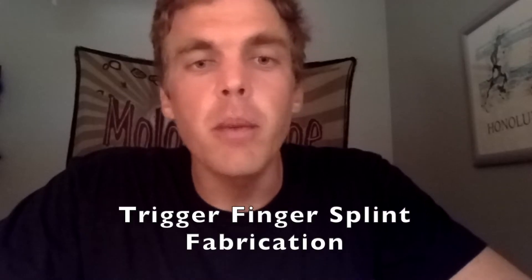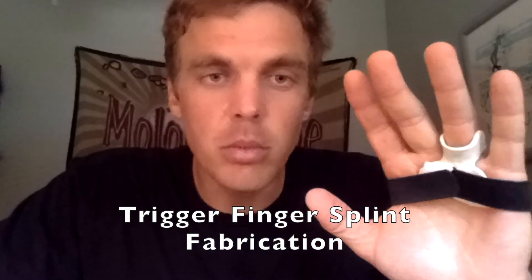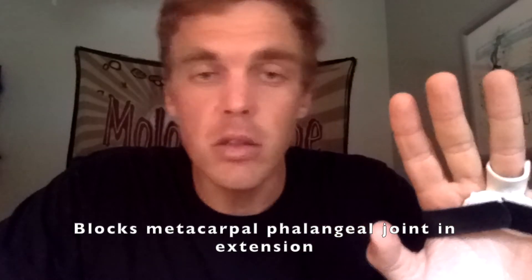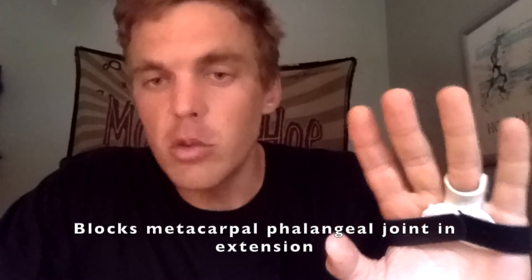We're going to demonstrate the fabrication of the trigger finger splint. We use the splint for patients that have trigger finger of the index to small finger. What it does is keep the metacarpophalangeal joint blocked in full extension — that's the only joint that is blocked. You can still move the PIP, DIP, and the wrist. Limiting MP flexion is what we're trying to do.